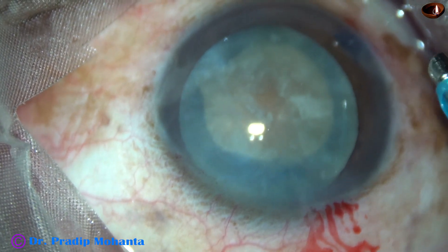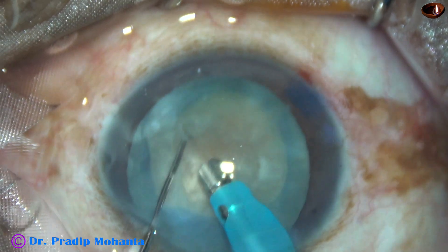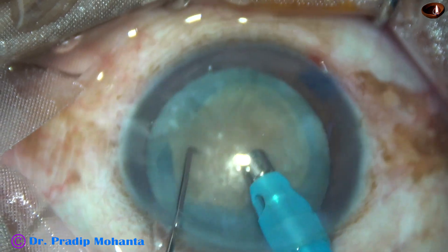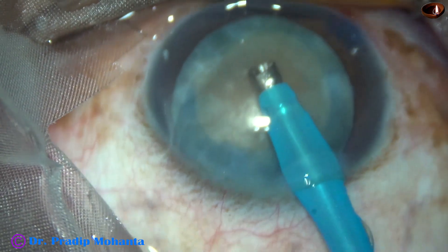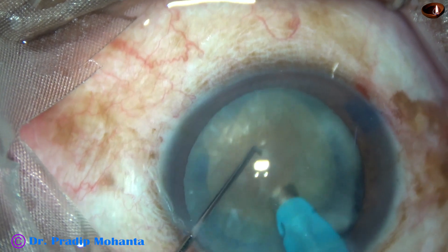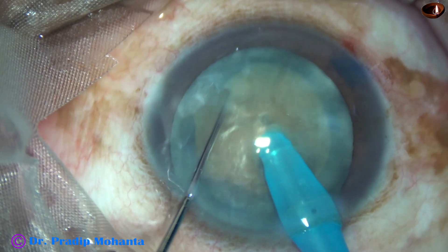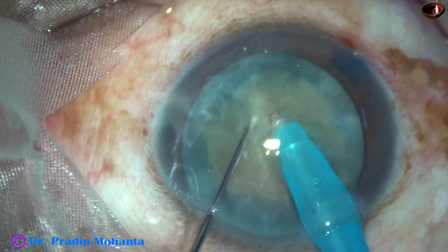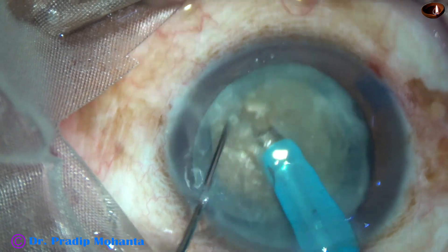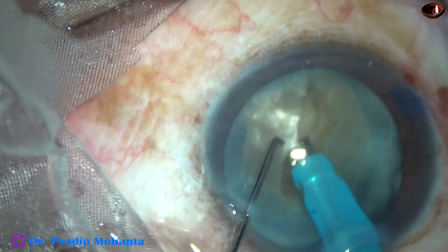The exposed part of the tip is adequate. The nucleus is quite hard — you can see the brown tinge of the nucleus. This is grade 4 nuclear sclerosis. Now the tip is buried into the substance of the nucleus and the tip goes towards the opposite equator. I try to chop this nucleus, but I could not. Ultimately I got a very nice crack.